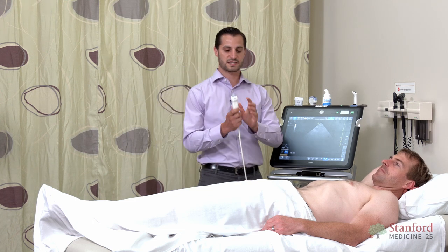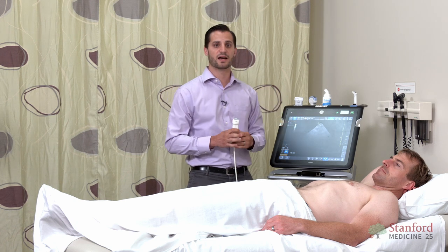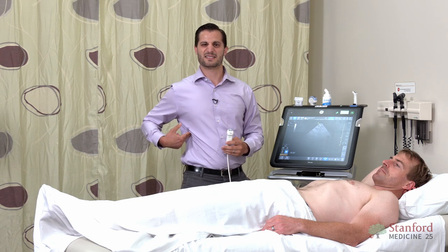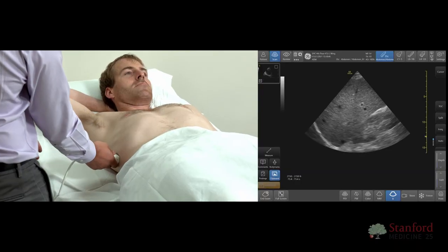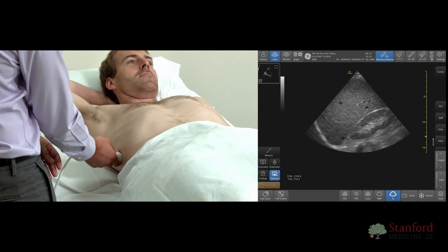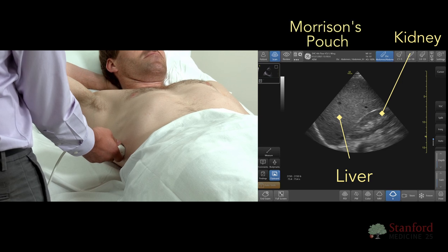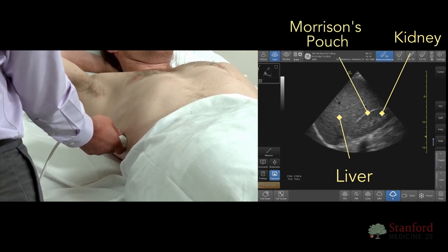I'll have my orientation dot pointed towards the patient's axilla. I'm generally scanning in the mid- to mid-posterior axillary line, about in the 8th to 10th intercostal space. In this particular image, I'm looking for fluid in an area called Morrison's pouch. On this image, we see the liver and the kidney directly juxtaposed to each other. Morrison's pouch is an imaginary space in this instance between the liver and kidney.